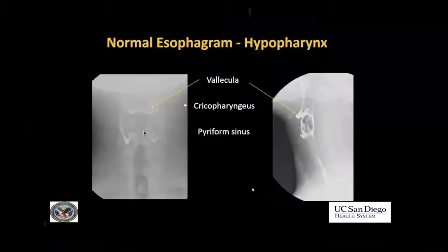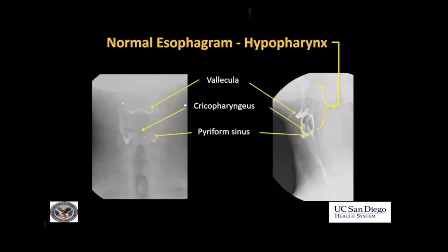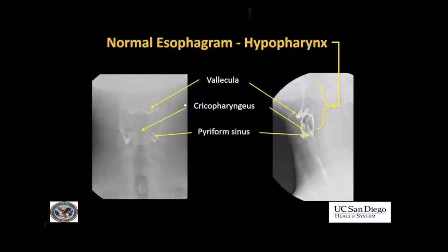So we'll start by talking about the esophagus. First of all, let's just have a look at the normal anatomy. In the upper esophagus, you have paired valleculae and bilateral piriform sinuses seen here. Valleculae are well seen on the lateral view; piriform sinuses are less well seen. This whole area is the hypopharynx.